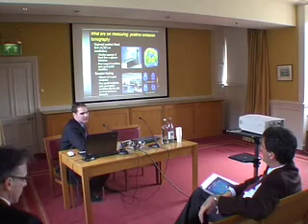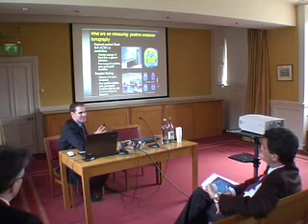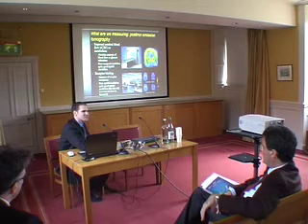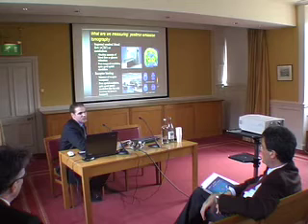One thing that brain imaging studies with PET really still have the advantage on is measuring the brain's biochemistry. So it's one thing to measure brain activity, but I should also measure receptor binding. If we want to understand how many dopamine receptors a subject has, or what concentration they are, or how much dopamine gets released when we give a subject a particular stimulus, we can only use PET, so that's all we have.